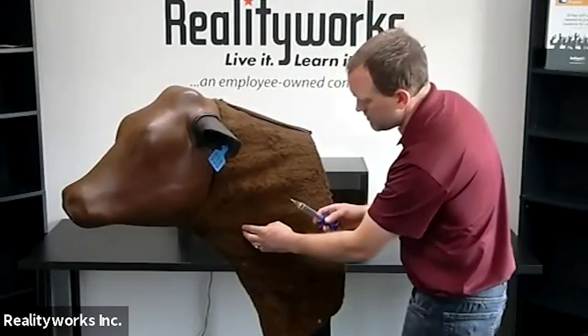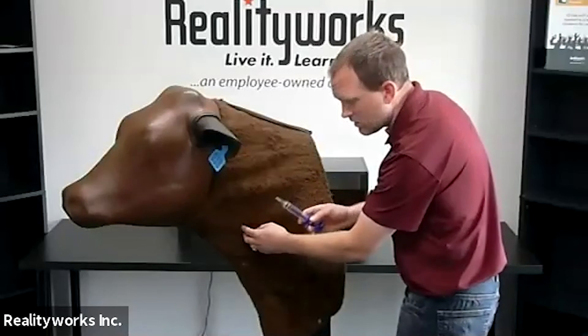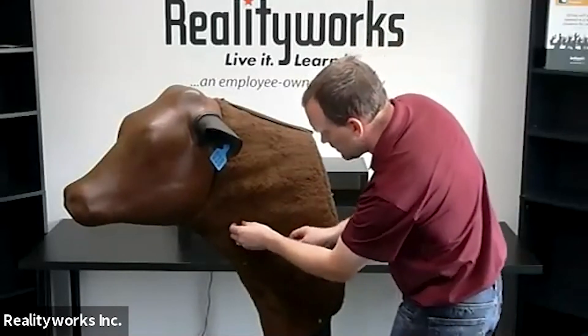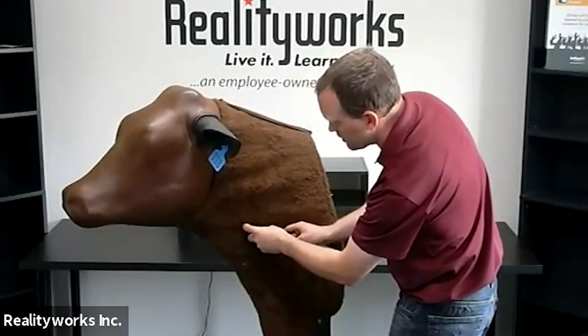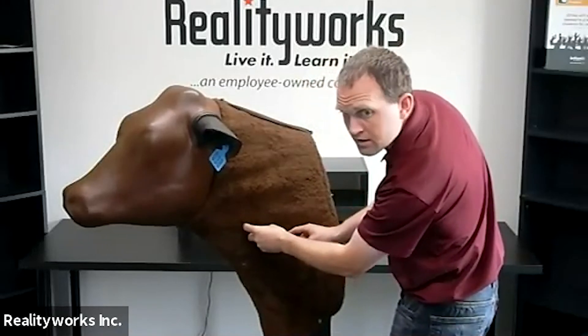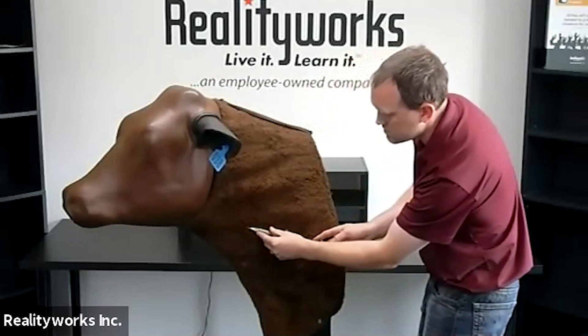Take a syringe and at a 30 to 45 degree angle insert the needle, then draw back to withdraw the fluid.